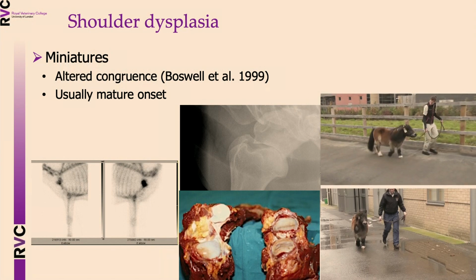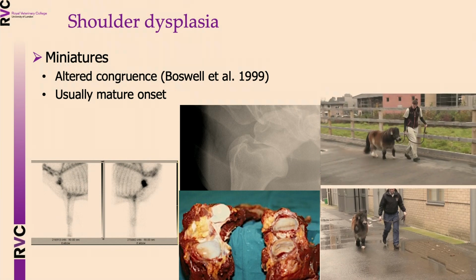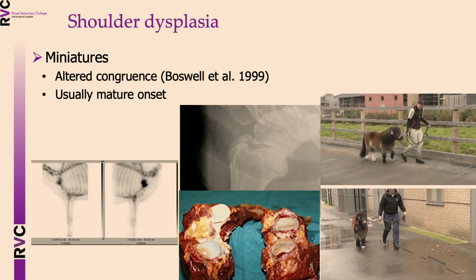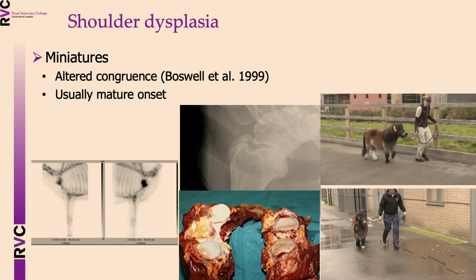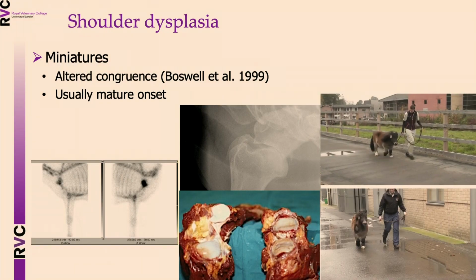So this is a Shetland pony, which is very, very lame.